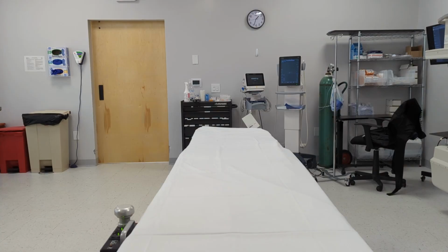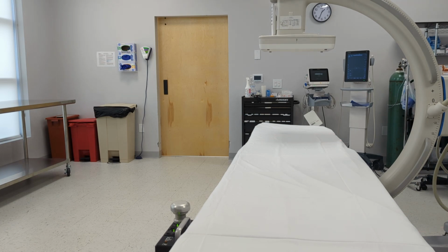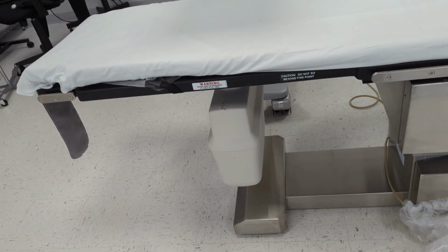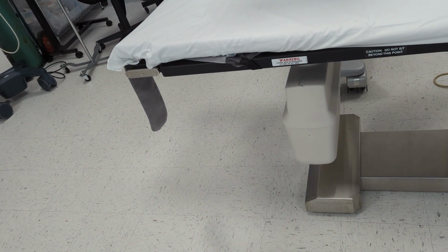Next, I will bring the camera over the table, and we can use the laser to center the receptor to the table and the patient. Now that everything is centered, we should not need to move the camera during a pelvic case. And once everything is centered, I make sure that I left myself enough room away from the base of the table to angle cranial or caudal if we need to.